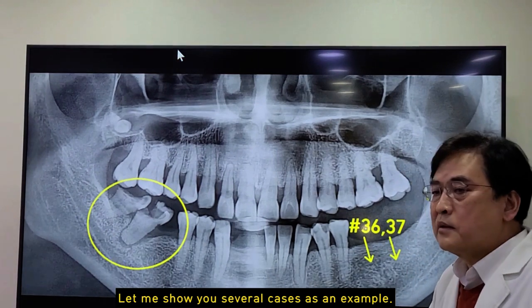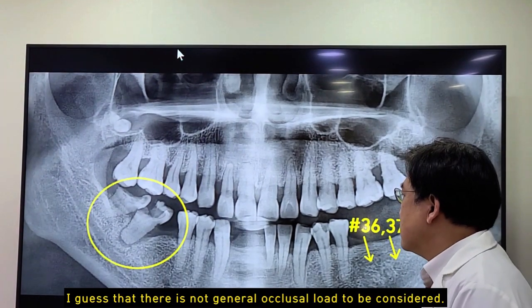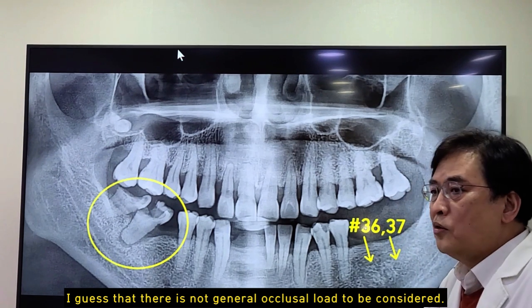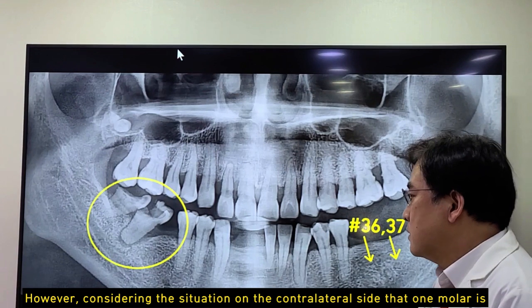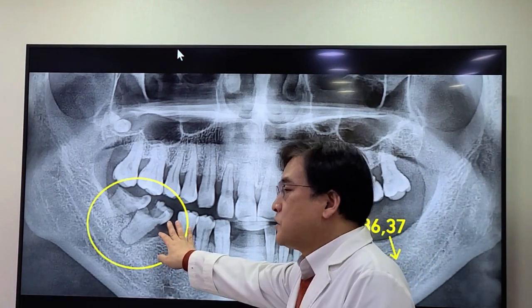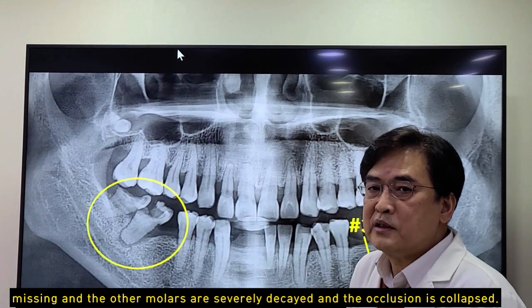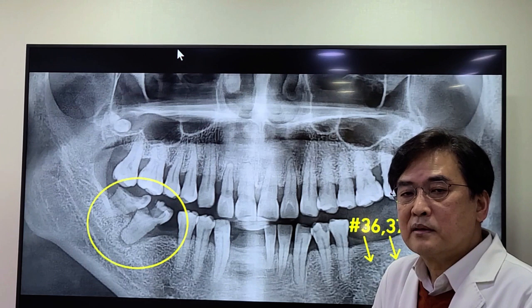Let me show you several cases as examples. I guess that there's no general occlusion load to be considered. However, considering the situation on the contralateral side, one molar is missing and the other molars are severely decayed and the occlusion is collapsed.